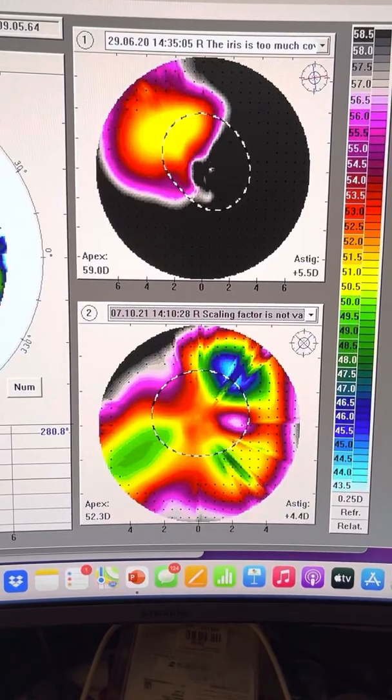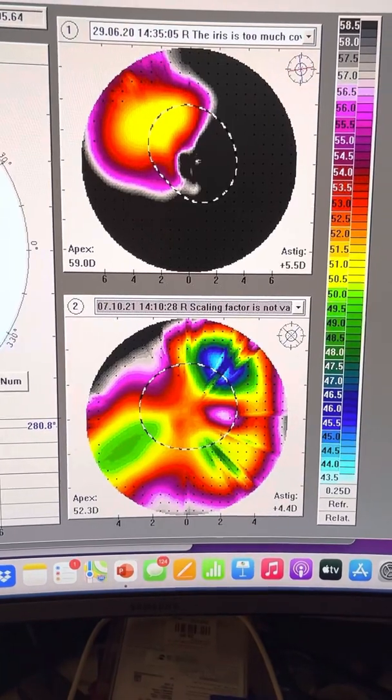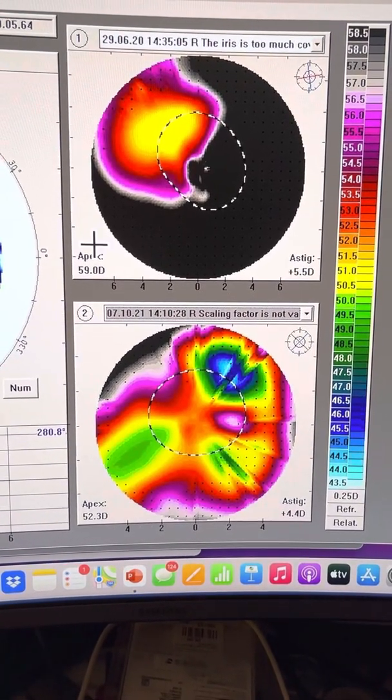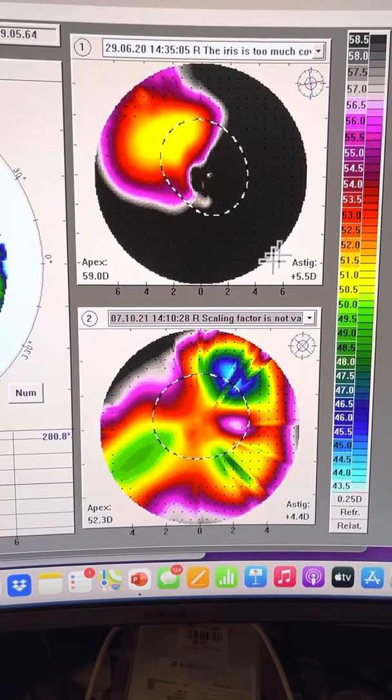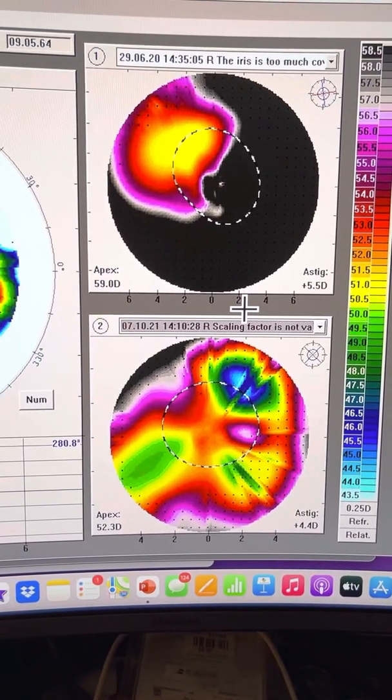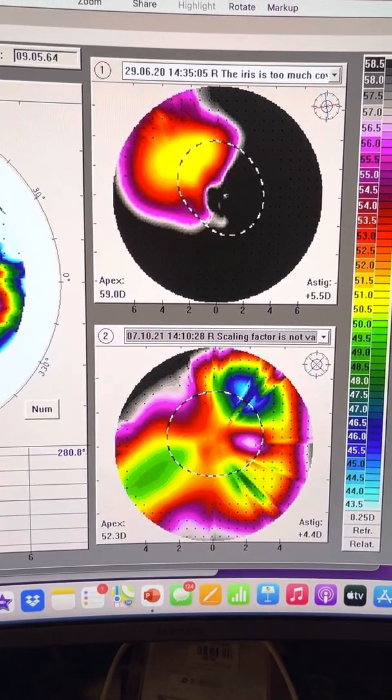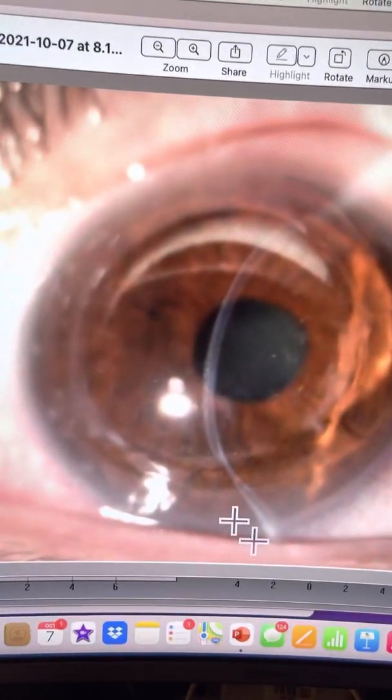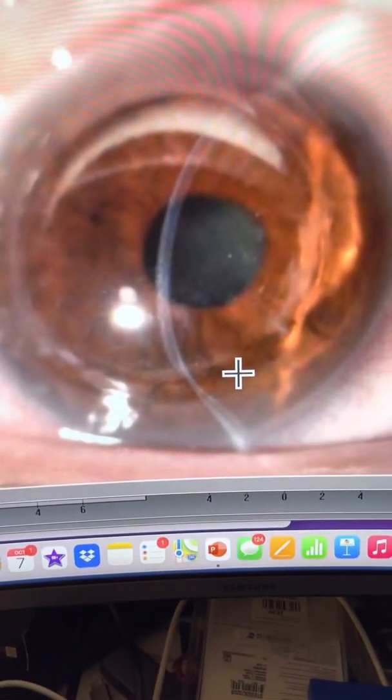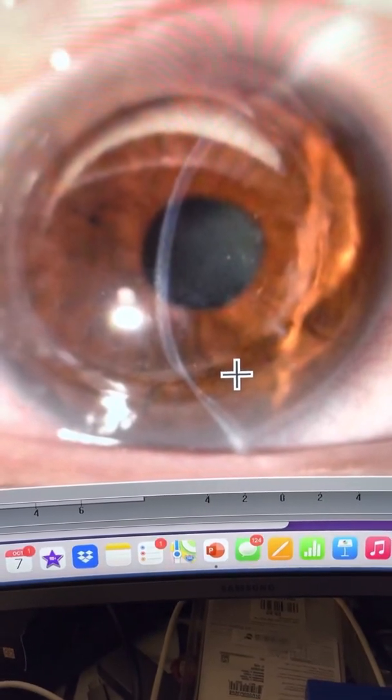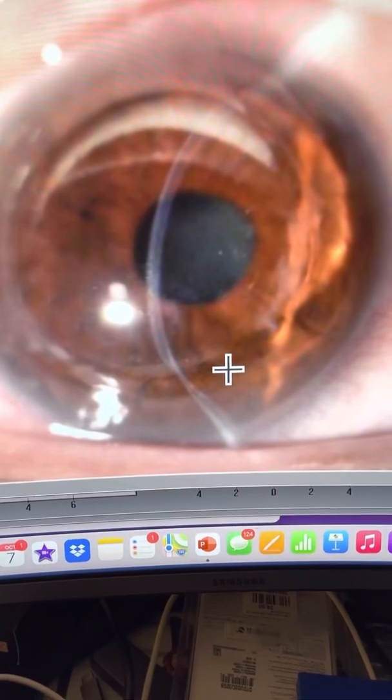And this is a pearl on how to deal with some of these eyes that some people, when I was training, called recurrent keratoconus. You may fall into the trap and consider this a case for laser refractive surgery, PRK or LASIK. A problem here because treating the central cornea will definitely not solve the gaping problem that we saw here. And by re-suturing the cornea, you can enable, of course, with some healing process involved, this patient to enjoy tremendous vision.